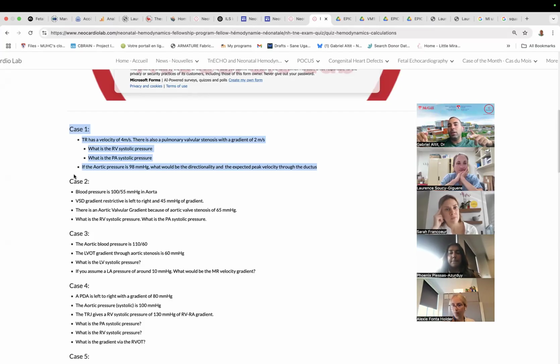Okay, well, clearly my aortic pressure is too high. So actually I need to act on systemic vascular resistance. That's a problem. I need to drop my afterload because my LV is failing. So it's things like that that are going to help you decipher a bit more what you're seeing on the image and bring it to the actual physiological information you want to get at.